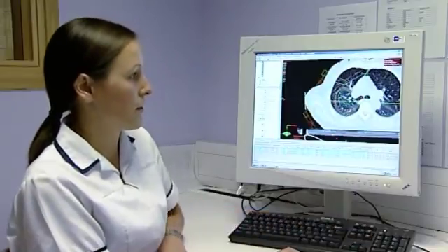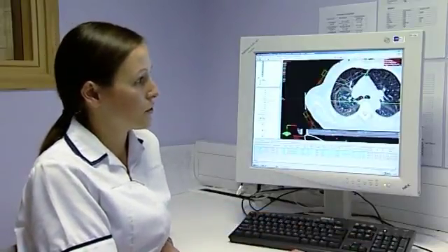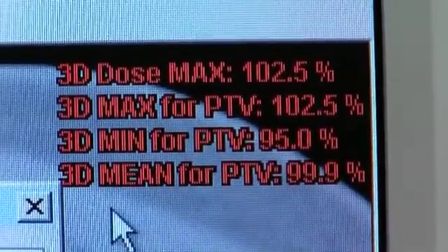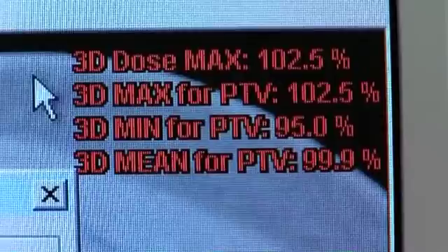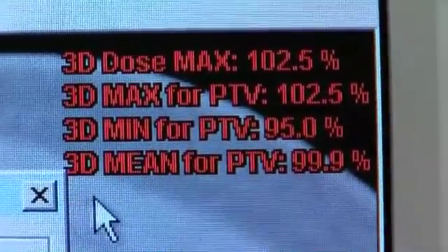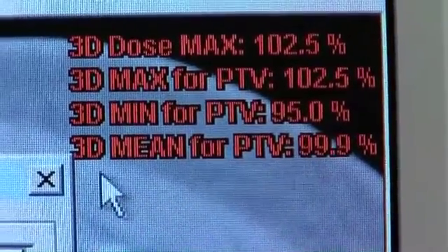We can see there that 95% is covered, and also here this information tells us that 95% is the minimum for the PTV. We also have a mean for the PTV of 99.9% and we have a maximum of 102.5%.